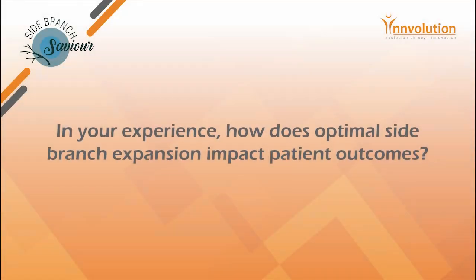Success in side branch intervention depends on immediate success and long-term success. Immediate success is purely based on your pinching and TIMI flow. Also, if the side branch is quite big and you feel there's a significant pinching, there is a role for doing an FFR through the main struts into the side branch and assessing whether it's significant, and then intervening on it if required. Long-term success depends on the clinical symptoms of the patient, and further imaging can also be done as a follow-up.